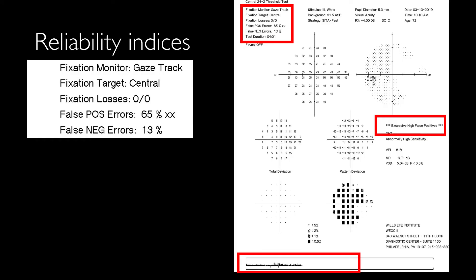For checking the reliability of the visual field test, we have several locations in the printout to check. At the top there's a box that shows the fixation monitor, fixation losses, false positive and false negative errors.